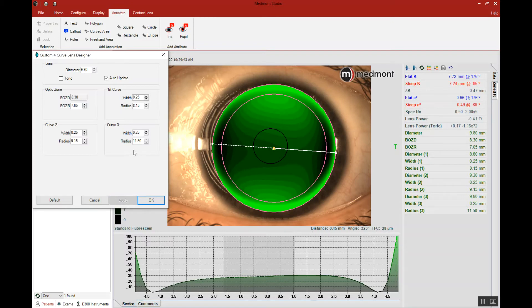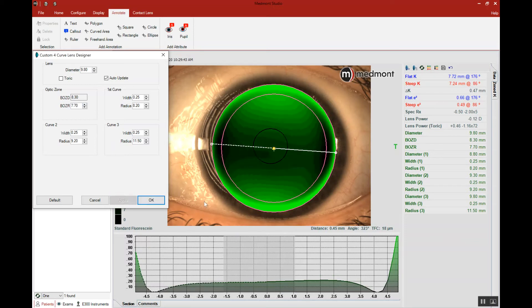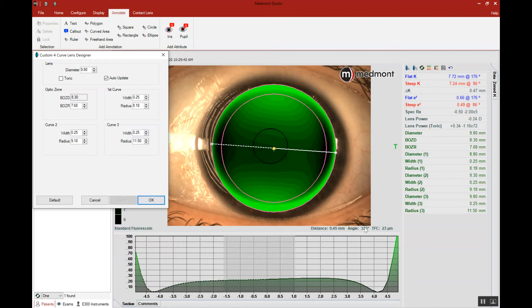Remember, our target is approximately 20. Let's flatten the base curve again, and that takes us to 18, so a little bit too flat. We'll steepen it up slightly to see if we can get to around 20. Now we're at 23.